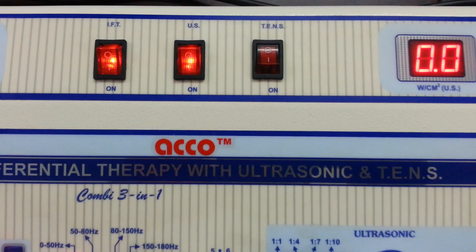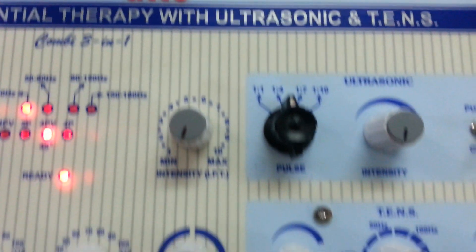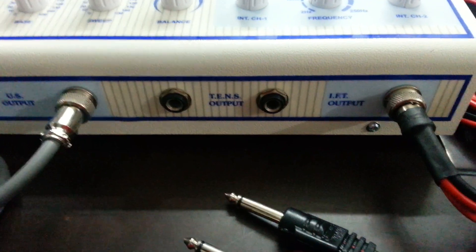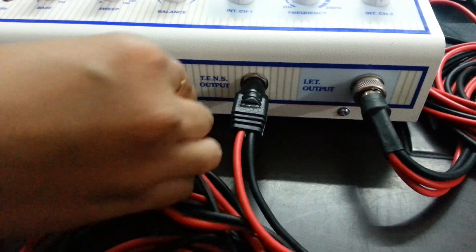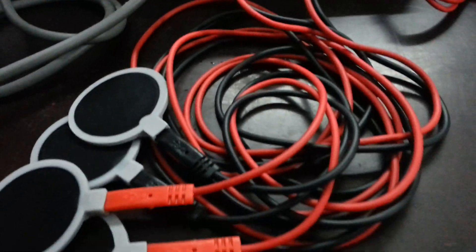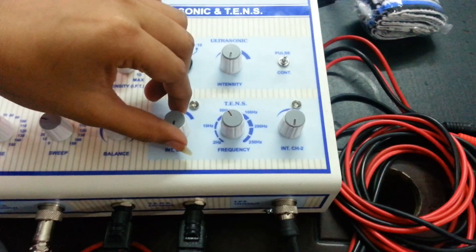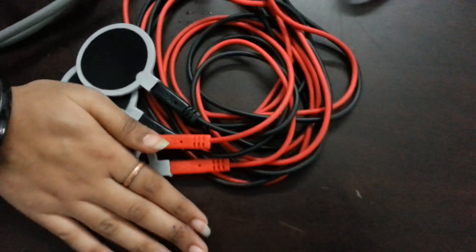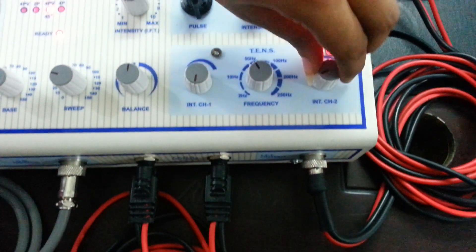And now we will show you the demo of the TENS unit. Switch on the TENS unit. Set the frequency as per your need. Attach wire and leads. Set the frequency as per your requirement. Increase the intensity on channel 1. Set intensity on channel 2 as per your requirement. After treatment is completed, make all the intensity channel knobs at zero.